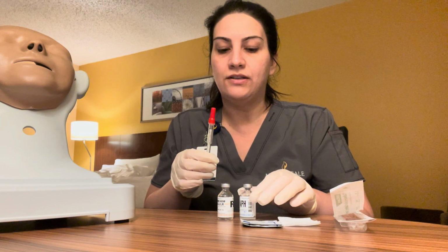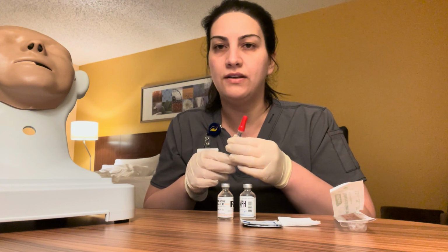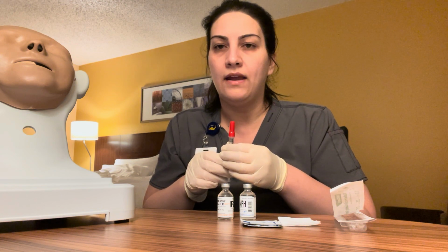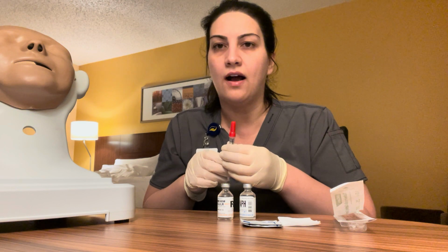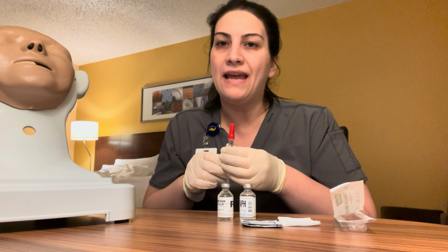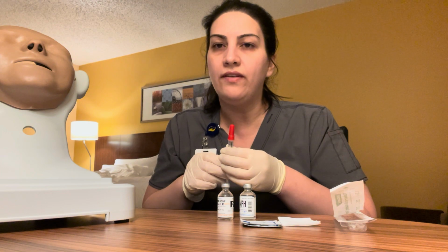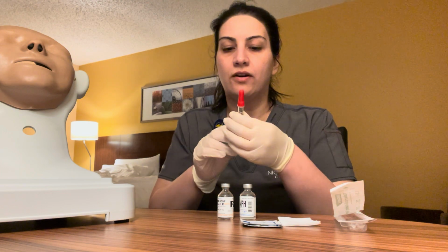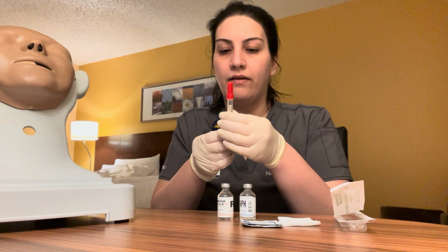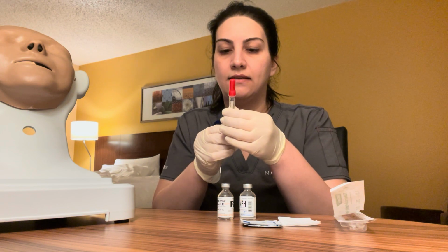And then next I'm going to draw up the air of 4 units of regular, and we're going to push in the air, and then we're going to invert, and we're going to draw up the 4 units of regular, and then we're going to draw up the 8 units of intermediate, which is going to equalize 12 units of insulin. So first we're going to start by going with the 8 units of air for the intermediate.